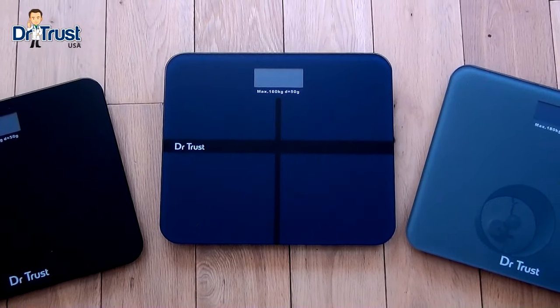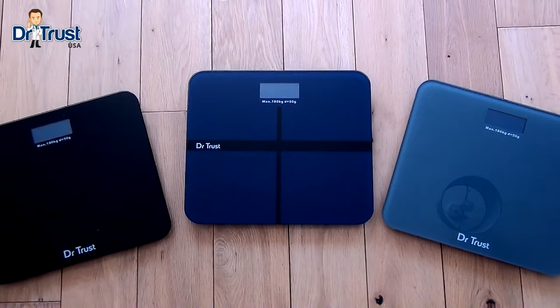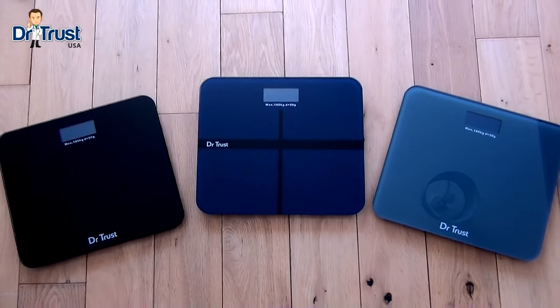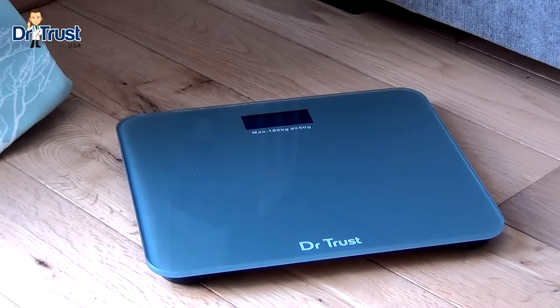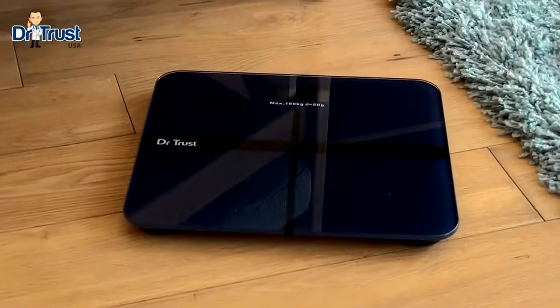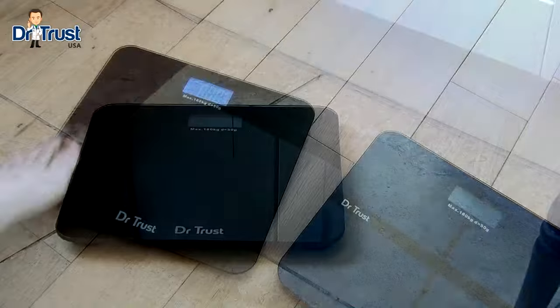Introducing the Dr. Trust range of rechargeable personal scales for eco-friendly, affordable, and high precision weight management at home. The Dr. Trust rechargeable scale comes in three models — Platinum, Executive, and Zen — to suit your home decor and personal style.